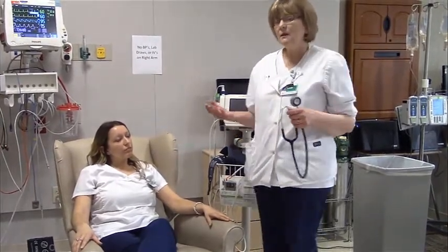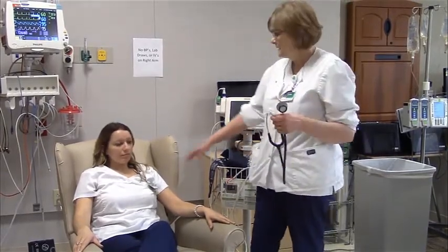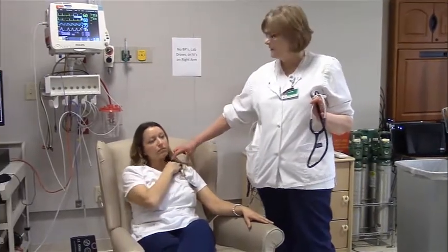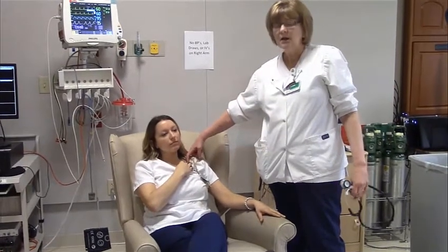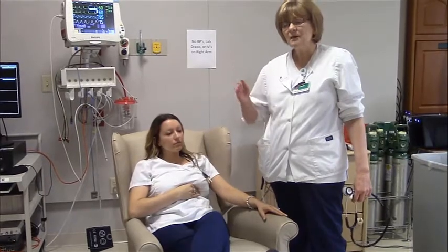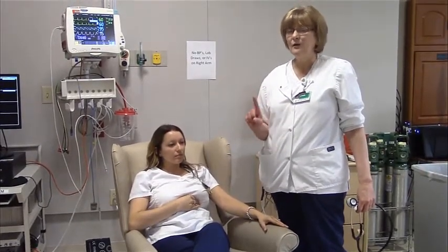So what we need to know are our landmarks, because again, we're placing this against the chest wall. So for my patient here, I want to find mid-clavicular. For those of you, that's your collarbone. We want to find the halfway point in the collarbone, and it goes down to the 5th intercostal space. Now, the intercostal spaces are the dips between the ribs. Now, that will lie below breast tissue.